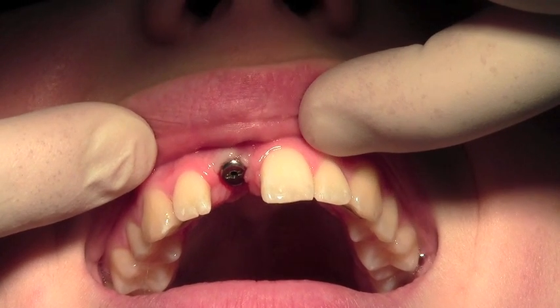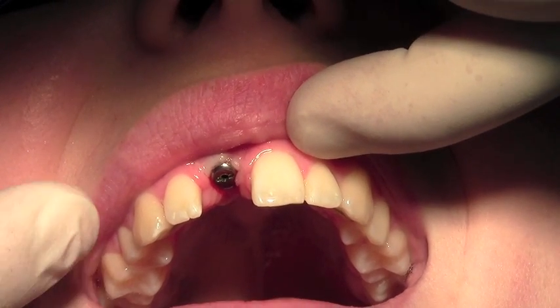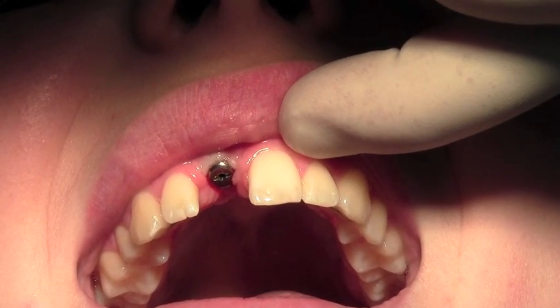Here we've got the implant with healing cap in the upper right central incisor position. This is a 3.8mm Zive implant, which you can see colour coded because of the gold coloured healing cap.